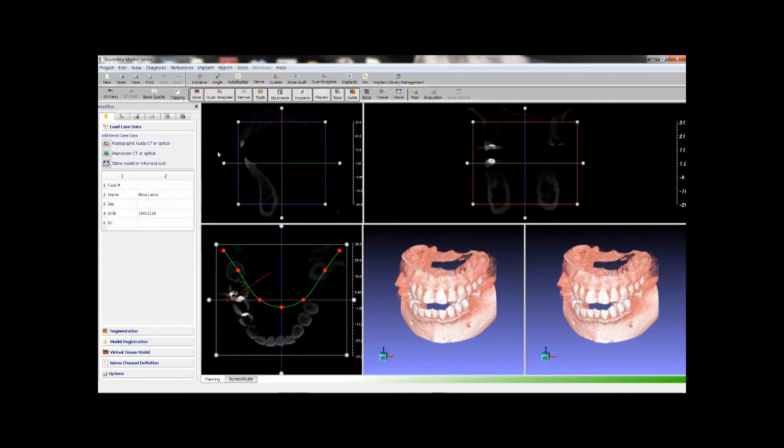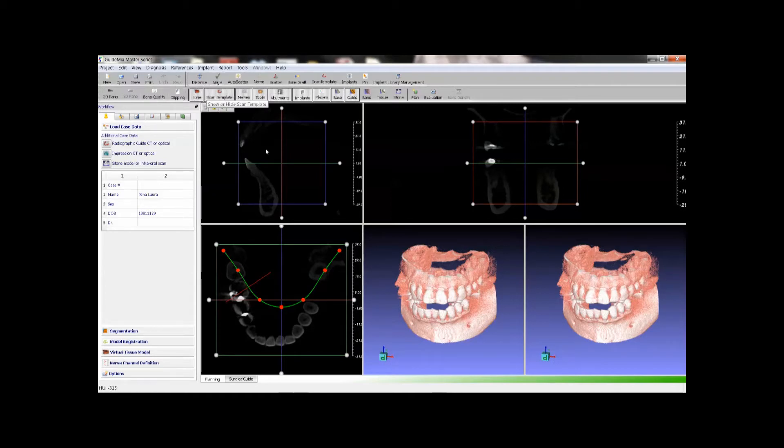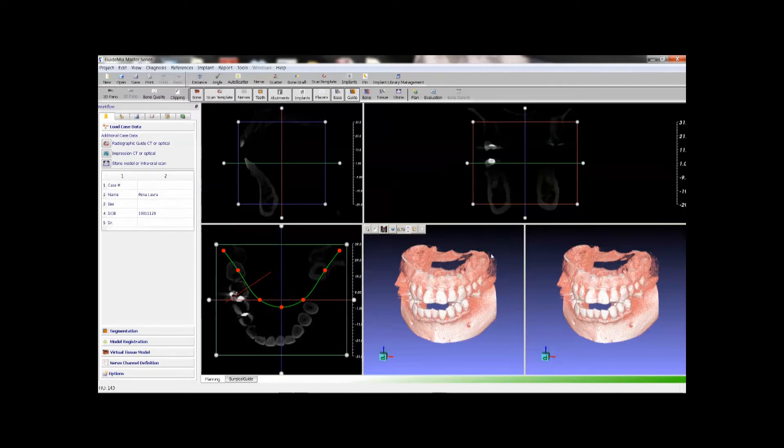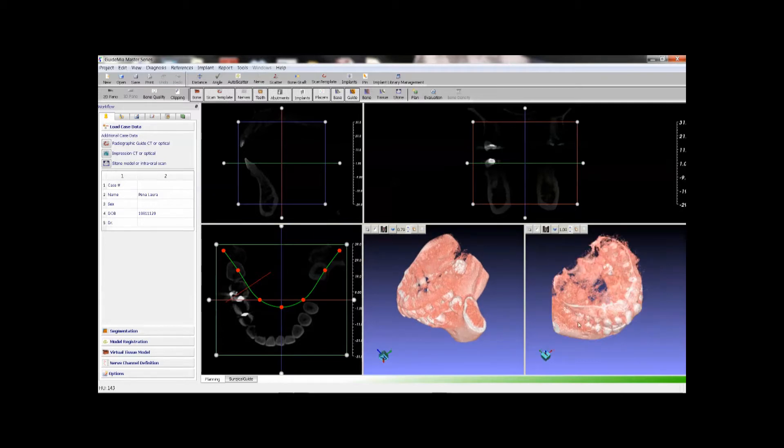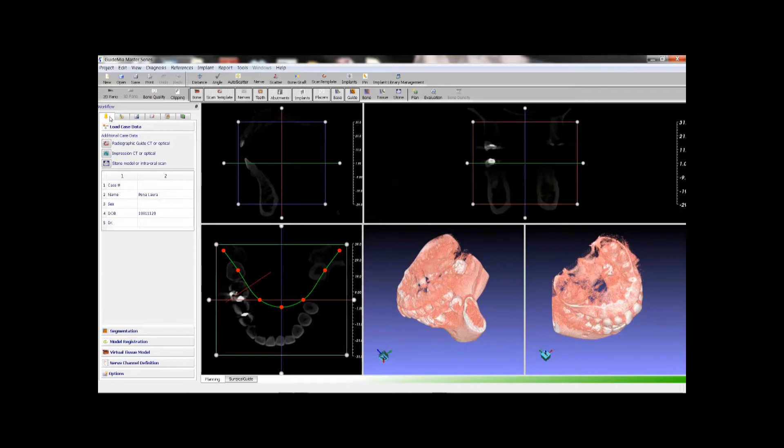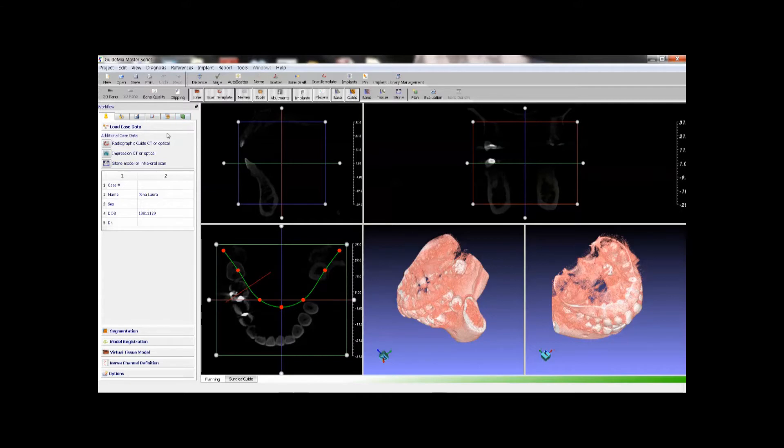The system will load the data set. GuideMeer user interface has menus, toolbars, sagittal view, axial view, coronal view, a 3D window for the working object, a 3D assembly view, the workflow panels, case preparation, treatment planning and analysis, diagnosis notes, object management, surgical guide design generate reports.